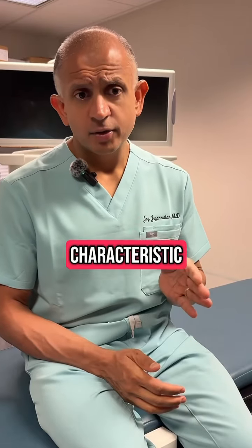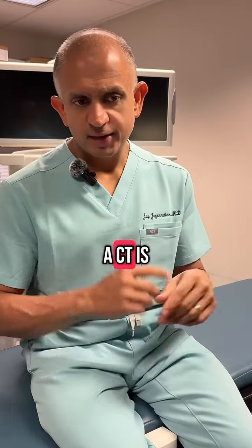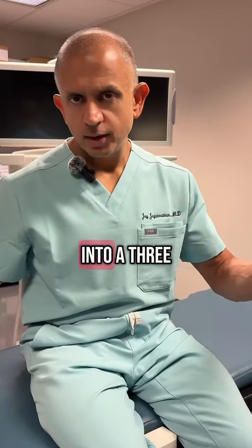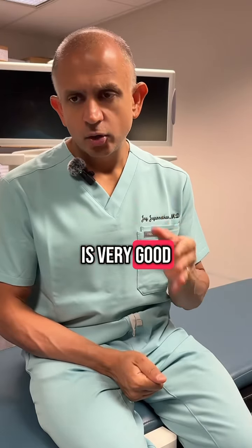A CT, by characteristic, in contrast, is a result of a radiation field. So basically, what a CT is, it's a machine which takes multiple small X-rays and superimposes them into a three-dimensional object, for example, a body. So a CT is very good for bony definition.